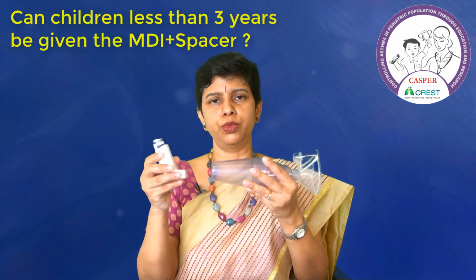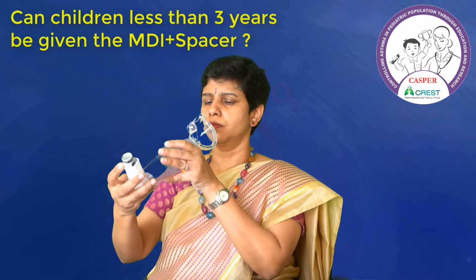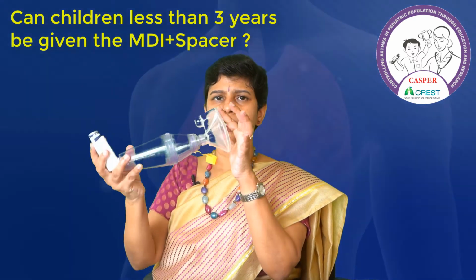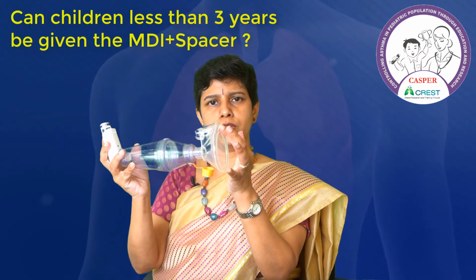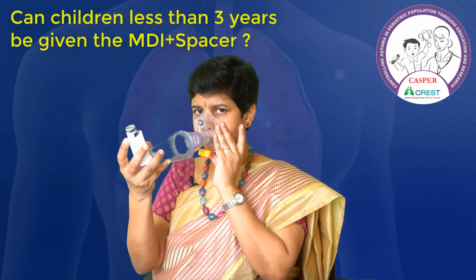All that you have to do is shake, connect, fix the mask snugly. There's a notch over here for the nose, so it fits snugly over here. Actuate and just allow the child to breathe in and out through it.